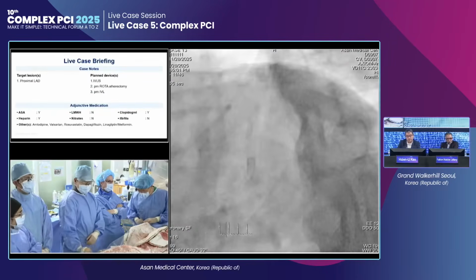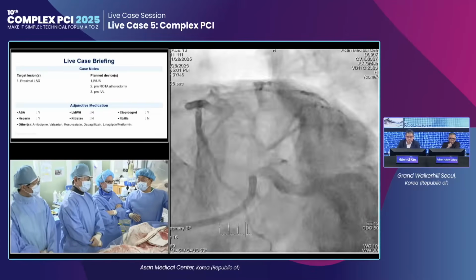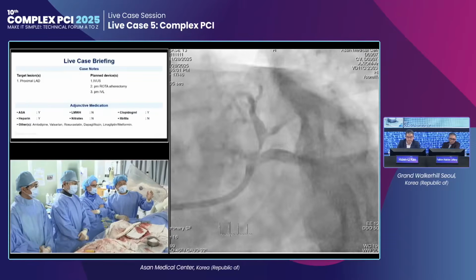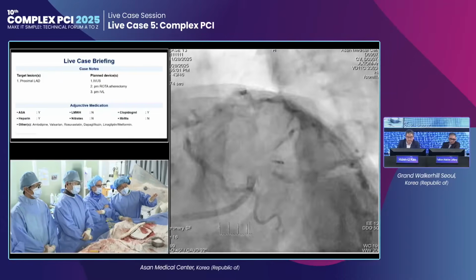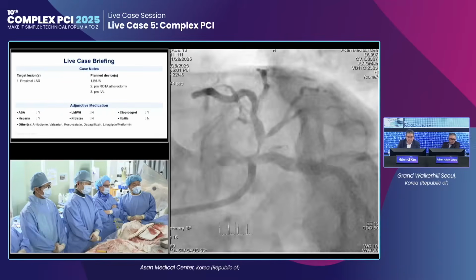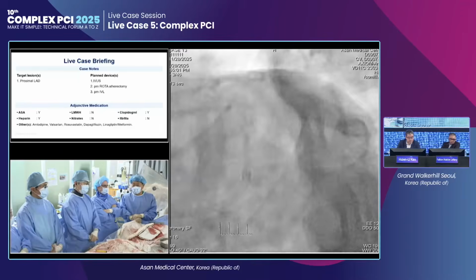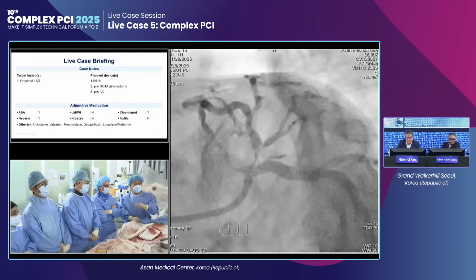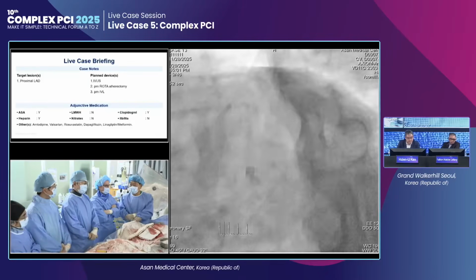Right. Angiographically this is not too complicated, right? Anyway, very big vessel, proximal LAD, short lesion length, relatively big vessel. However, we can expect some calcium, fluoroscopic calcification for that. Antonio suggests a lot of kinds of treatment for that. So, discuss first, how would you do that? And then, Antonio, you.